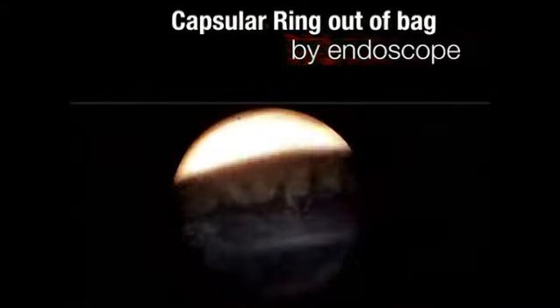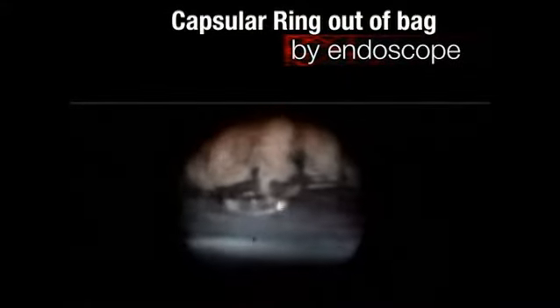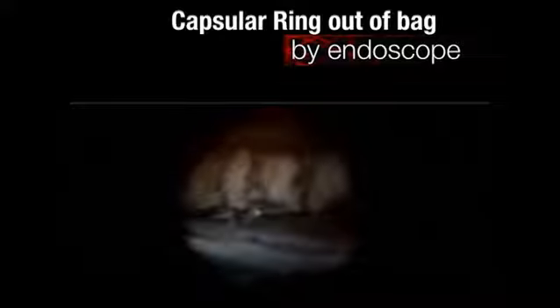In this case, one haptic loop of the capsular ring is in the bag and the other outside. It is possible to determine the exact moment when the ring protrudes from the capsular bag. Only by using endoscopy is it possible to confirm the position of the capsular ring. The body of the ring is positioned behind the ciliary processes in the pars plana region.